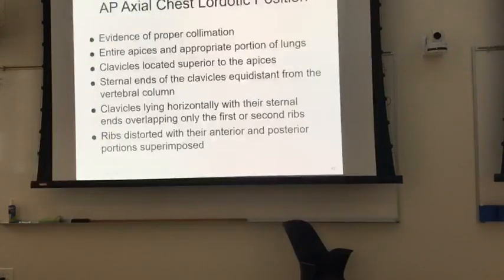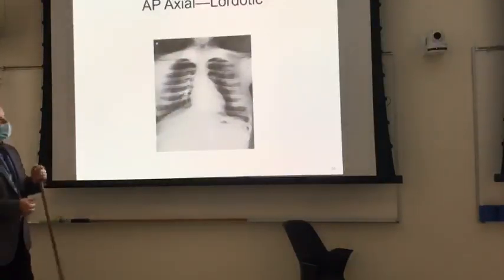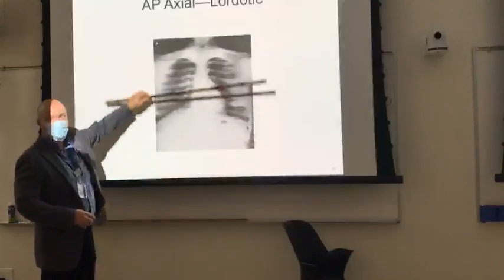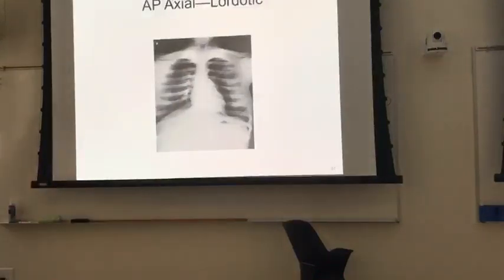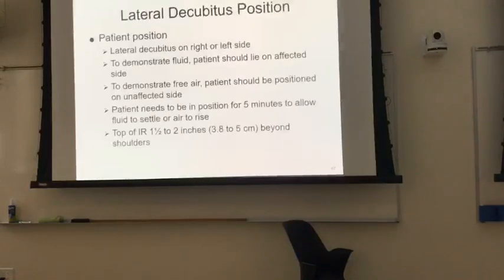And the ribs just look ugly. So it looks like that. Bad patient care, bad radiation exposure. That entire image should be about that big, okay? All of that should be gone. So your collimation should just be to the apex of the lungs. No reason to use an entire 14 by 17 right forward on it. Okay? Any questions?